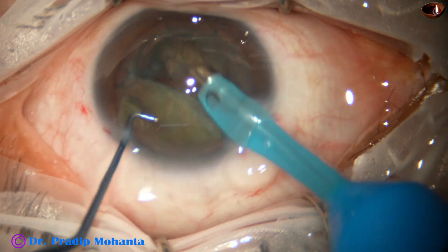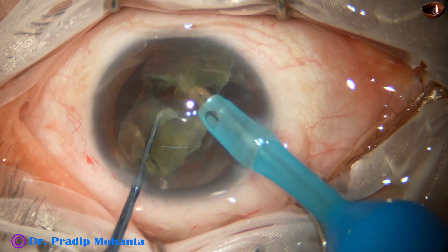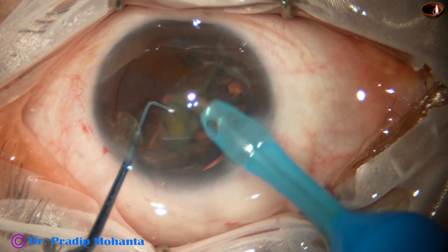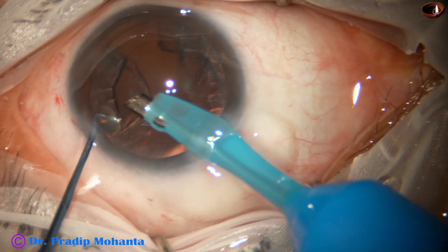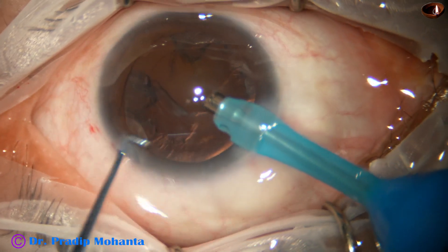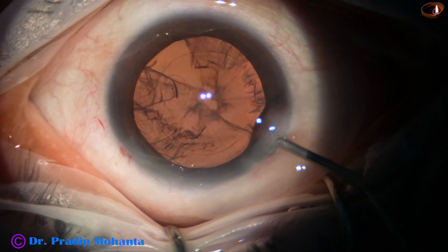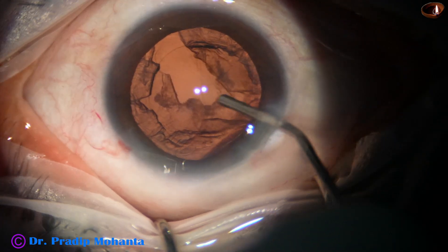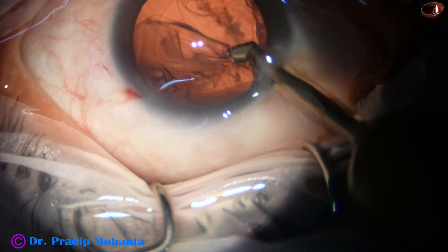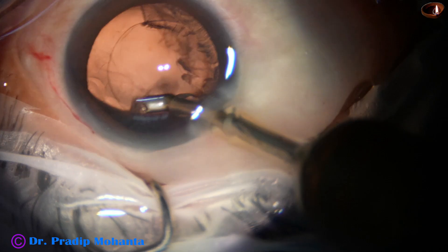The two pieces are emulsified. Now we come to this hemi-nucleus — it is divided into two pieces by the sustainer. In soft cataracts we do not need any sharp instrument to divide the hemi-nucleus into pieces; this round-bodied sustainer is fine. Some viscoelastic is used to fill up the capsular bag and anterior chamber, and this is coaxial I/A from Oertly — this is fast.